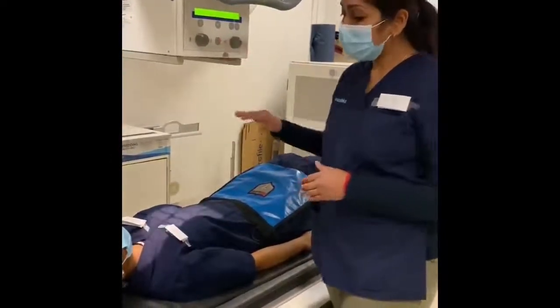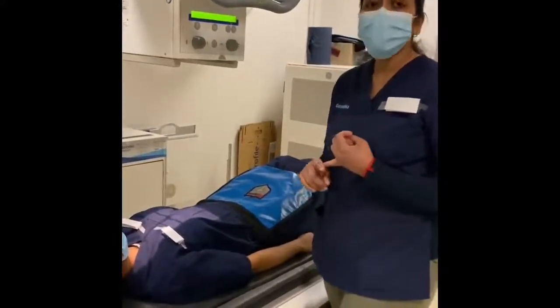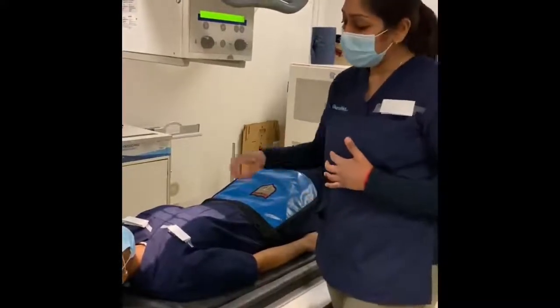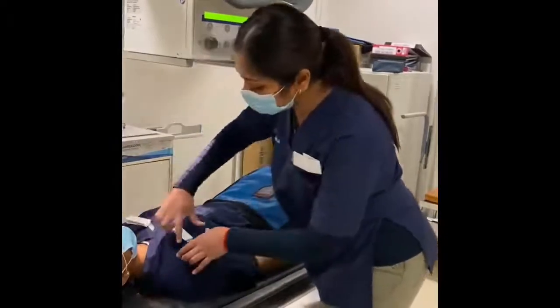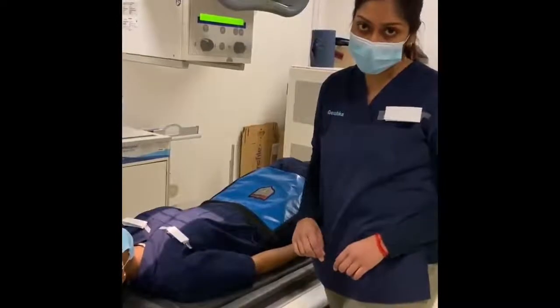To even out the density, you can use filters, which would normally be wedge filters or boomerangs, that you can place either behind the patient, or you can place your boomerang on top of the upper portion of your T-spine.